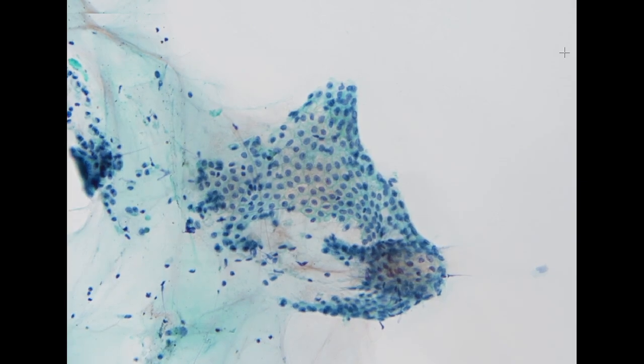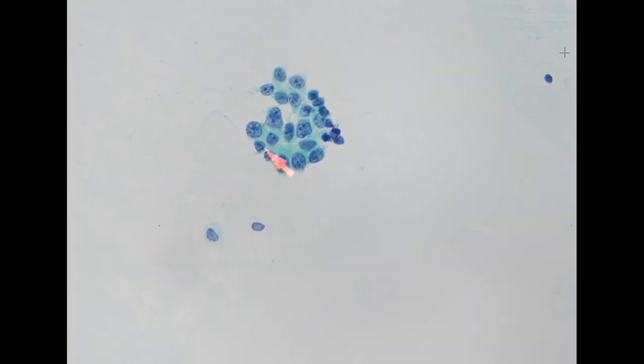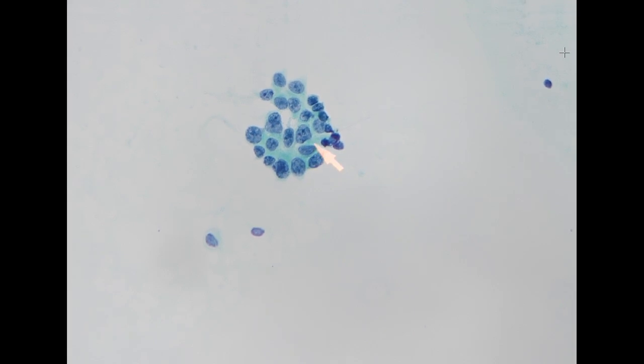In contrast to this, here we have some more atypical cells. You can appreciate that the chromatin pattern is already abnormal, and it is arranged in an irregular abortive type of glandular pattern, with some overlapping. The nuclear size is variable, and the shape and contour are also variable. So this looks very much like an adenocarcinoma.